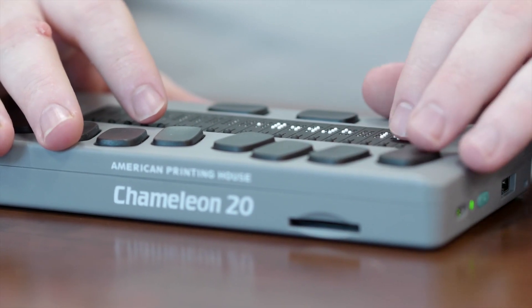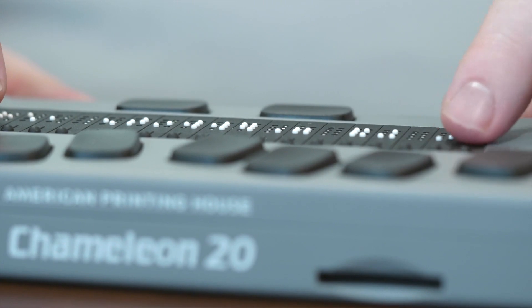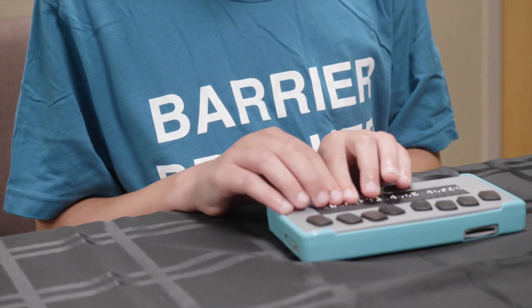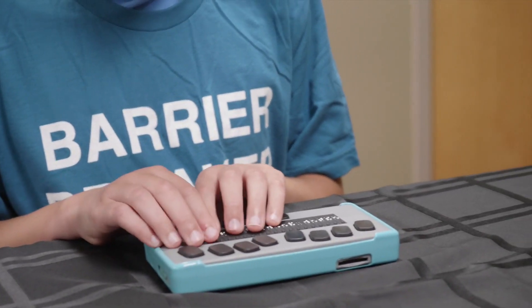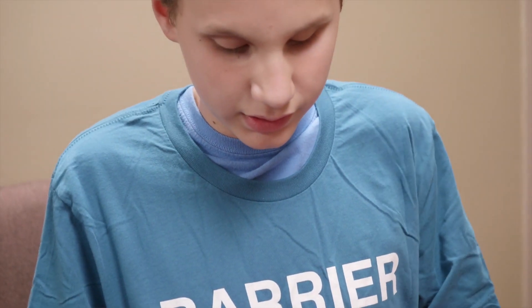There is a book reader that allows you to download and read books from both Bookshare and NFB Newsline. There's a calculator to do basic calculations, a clock for date and time, and a file manager to teach students basic file management skills — things like copying and pasting files or creating folders, making sure that the right class assignments are put into the right class folders.